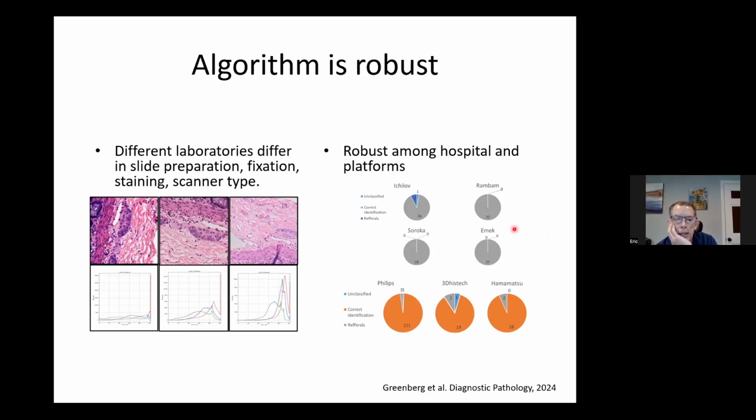Right. So you're just pointing out the variability in scanner, quality, coloration, et cetera, which you mentioned as a challenge earlier. Yeah. The same tissue, same area, different scanner. So the goal of those experiments was to check how robust the algorithm is in order to validate if we can deploy it across all different scanner types. Right. Different scanners, different hospitals, different staining protocols, to check how robust it is and if it's valid as a solution.